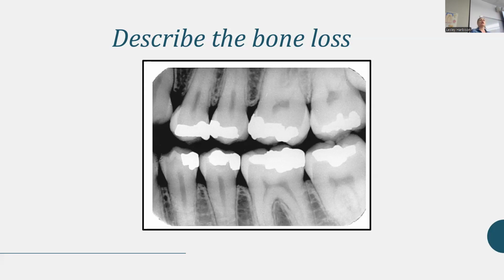Especially if you've had experience and looked at a lot of x-rays and talked with doctors, you could start to go down thinking, well, maybe this and that. But we're just going to take it broad because you don't have all the pieces to make a full understanding. That's what's hard about looking at just the x-rays. Maybe that is a little bit of the beginning of widening PDL and bone loss.